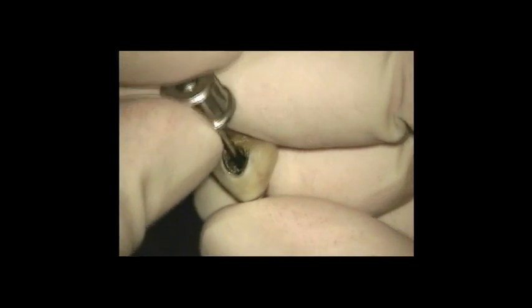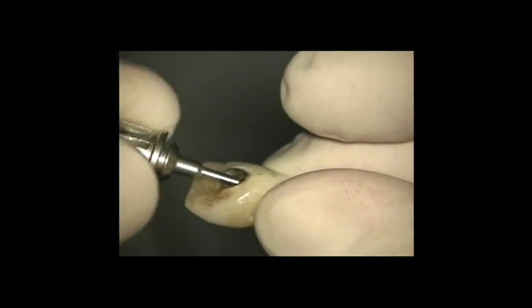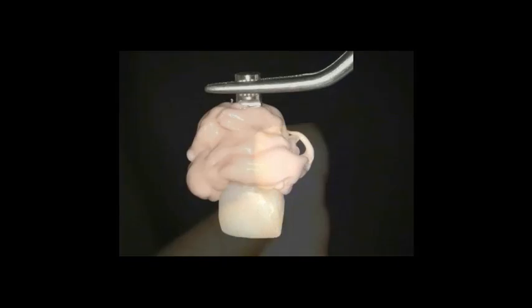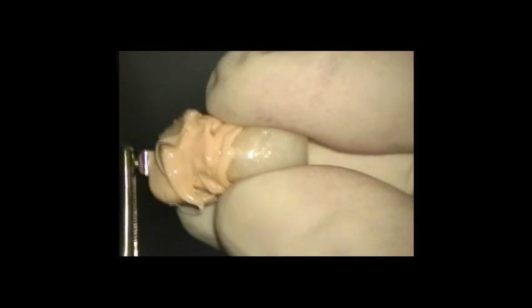I then coat the gingival third of this crown and the analog with a product called Mach 2 disilicone. What that does is it takes an impression of the gingival third of the provisional crown. You can use a heavy body impression material for this as well. I wouldn't use extra light, it would run all over the place. But the disilicone's been designed for this kind of work, so I like to use that.